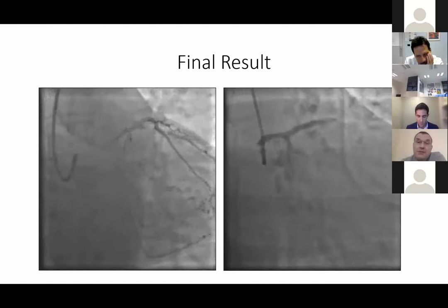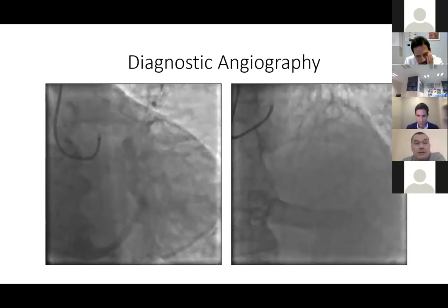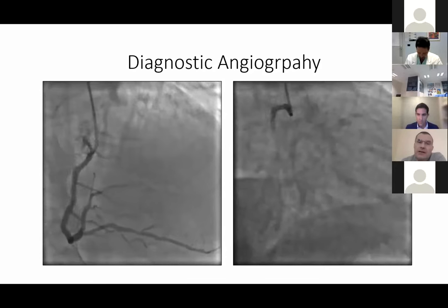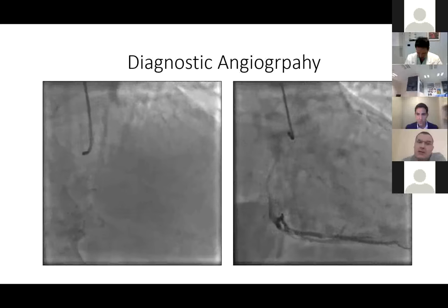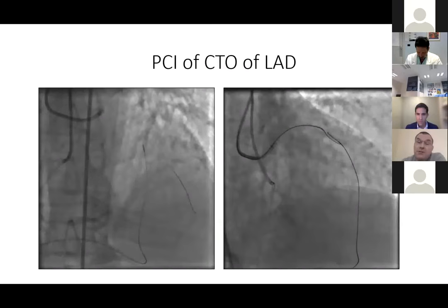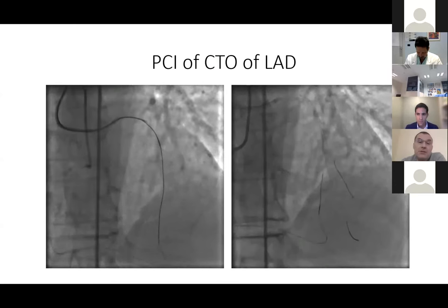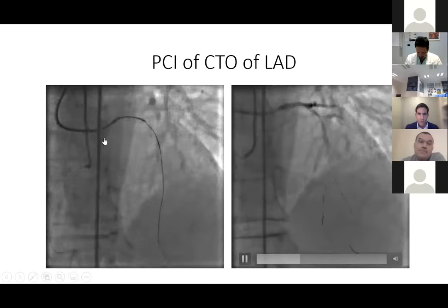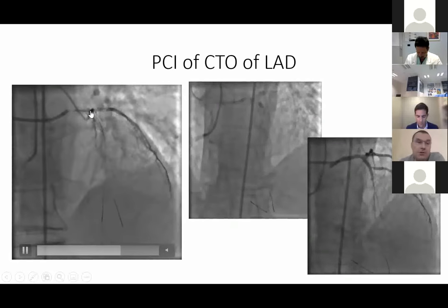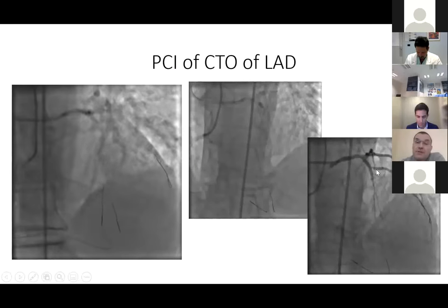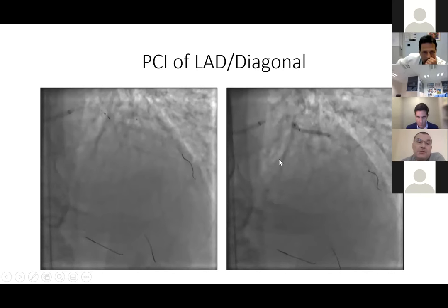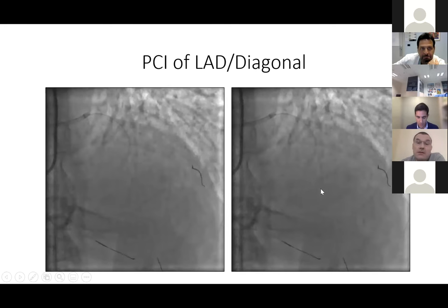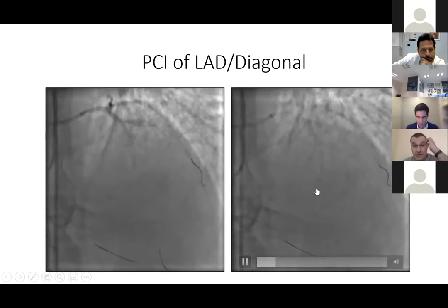The next case is a patient with low ejection fraction, three-vessel disease, and occlusion of the LAD with good collateralization. We decided to proceed directly with the retrograde approach and were successful in crossing the lesion. The antegrade wire was then replaced. However, after stenting the proximal lesion, a huge diagonal branch appeared severely pinched. After potting there was no improvement, so we made the POKI with a long balloon — a peripheral 2.5 by 80mm balloon — with a very good restoration of the patency of the diagonal and distal LAD.